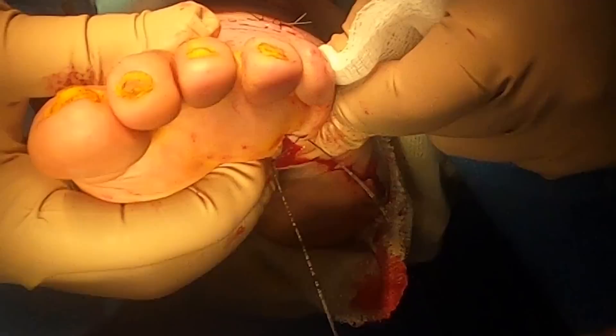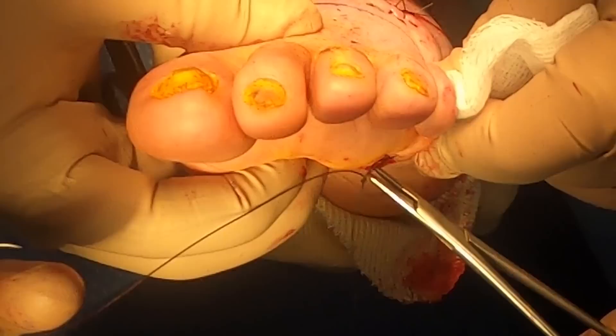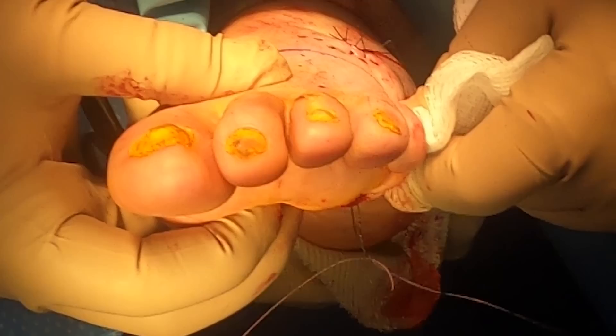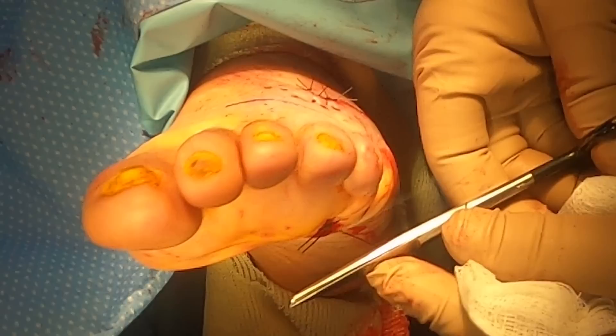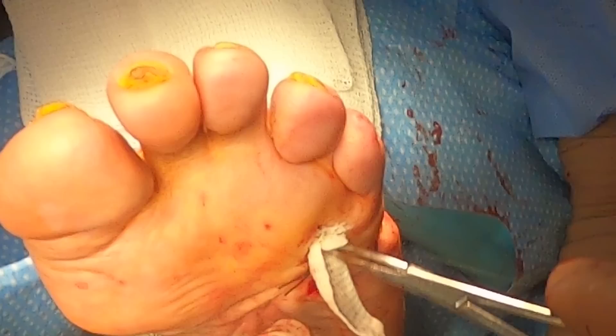We've got this void in that foot that needs to be filled with something. We're going to fill it with what we call iodoform gauze or iodoform packing. It's a packing that has an antimicrobial property to it and will help to soak up as much of that drainage as possible. We'll remove that later on. I'm going to have my assistant squeeze those tissues together so we can get a really good, almost bolster-type stitch to bring those edges a little bit closer together — not to close it like an incision on top, but solely to bring them together.